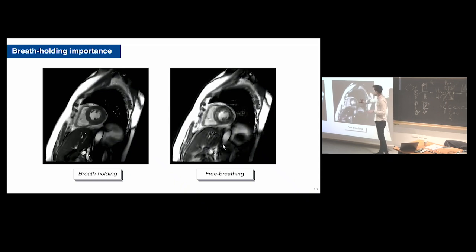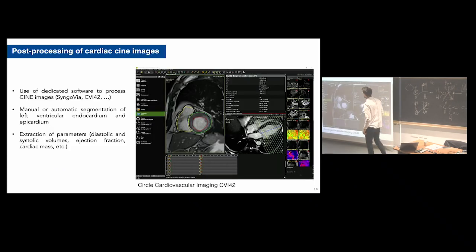And we have tools to correct that, motion correction tools. I'm not going to detail this technology, but Matthias gave a very nice talk last year here in Cargese on motion correction, so I'm sure it was recorded. Then we have the cardiac cine images. If we have cardiac motion, we will repeat the acquisition with a better breath hold.